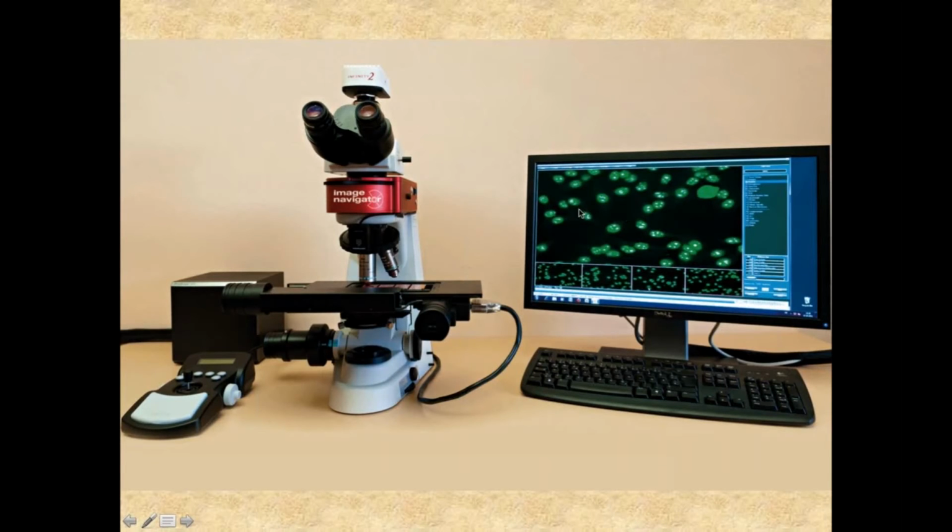So this, again, frees up the clinical lab scientists to do other tasks while the instrument is capturing the images, and then it displays them, and the clinical laboratory scientists can look at them on a monitor instead of through the microscope, and can make the diagnosis and assist the clinician in that fashion.